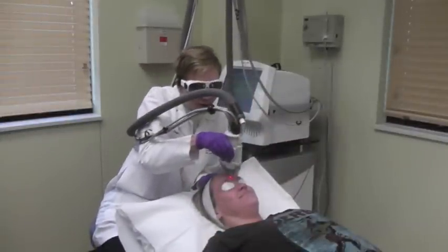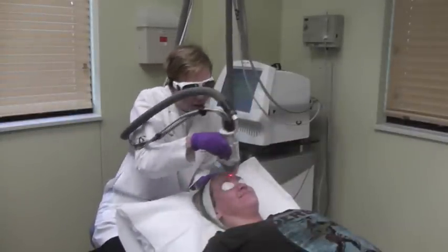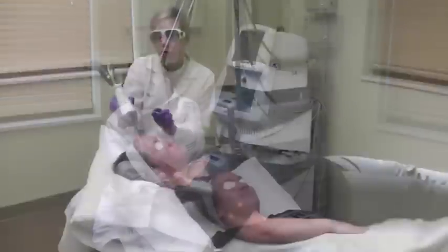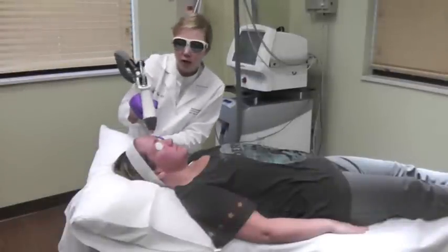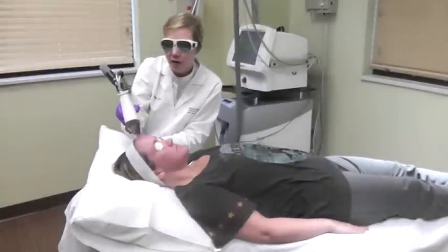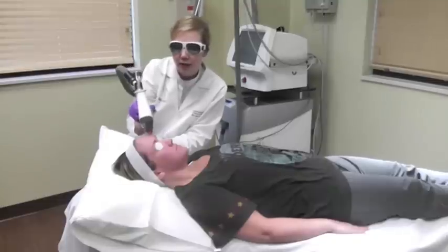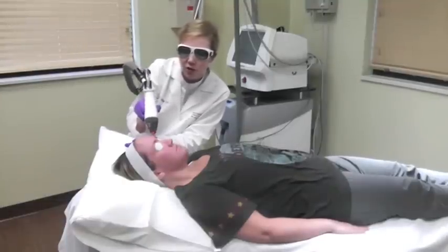I always tell everybody, we don't kiss and tell here in dermatology, so your secret's safe with us if you don't want to tell anyone. This has to be actively rolling to actually trigger the laser being able to fire, and that's a really wonderful safety feature for this laser.